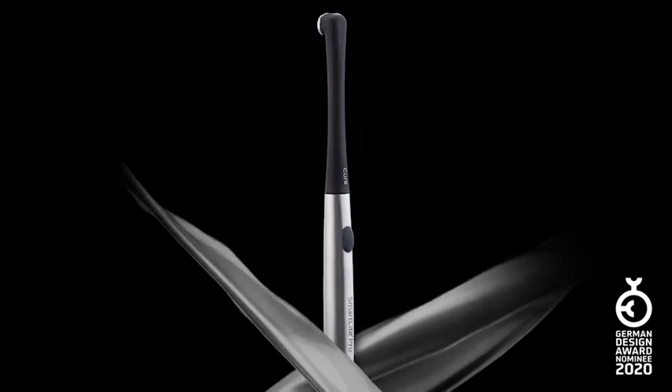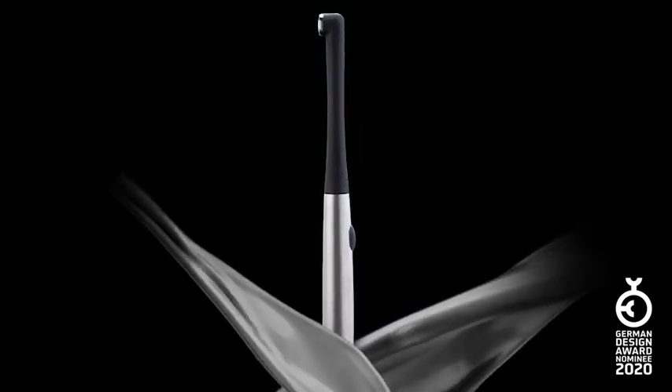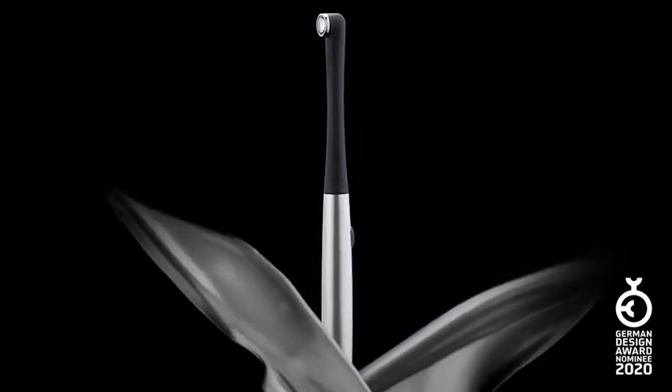Introducing the SmartLite Pro Modular LED curing light, one of the simplest and most versatile dental instruments you will ever own.